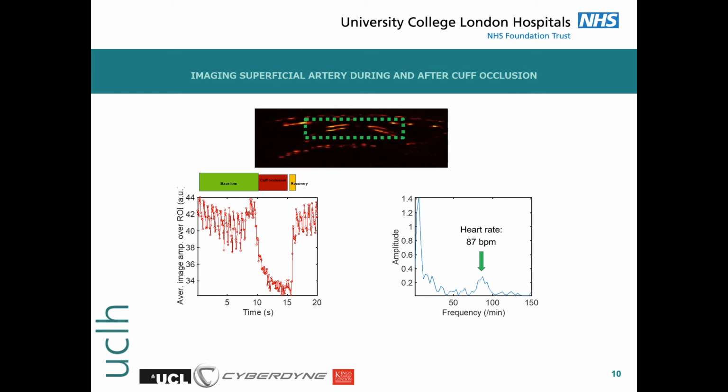You can see how the pulsatile flow is initially visible. As the cuff pressure increases, flow reduces, and then when cuff pressure exceeds systolic blood pressure, flow ceases altogether. It's then rapidly reinstated as cuff pressure is released to below systolic and back to zero. This technique demonstrates the capacity for high frequency sampling rates in the photoacoustics, as well as in the ultrasound image.